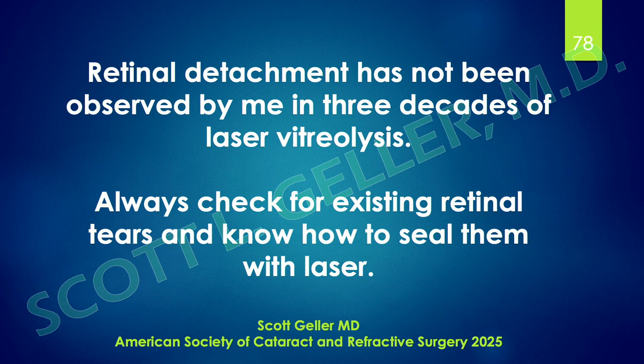This can avoid problems. And if you have a retinal detachment that you've not detected, or retinal tear, and then it develops into a real detachment after laser to the vitreous, of course, you're going to get that bad reputation: look what he did to this patient. It's going to be all over town with your colleagues, and the patient's going to blame you too. So be careful.